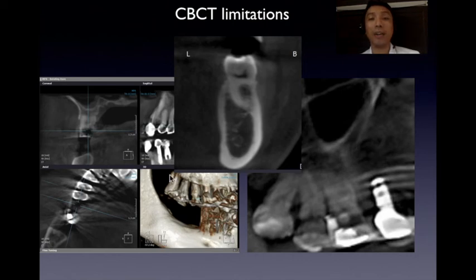Like what I've said, we cannot get it all, and we still have to account for that. That's why most CBCTs are continually being updated and upgraded in terms of how they could increase not just the reliability, but also the predictability of the images that we see, that may help us diagnose and therefore create a better treatment approach or plan for our patients.